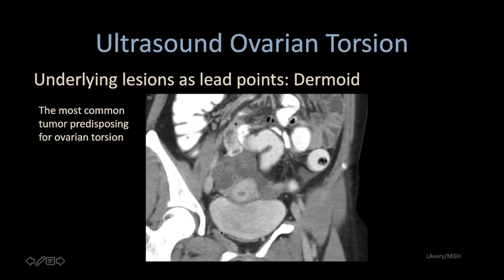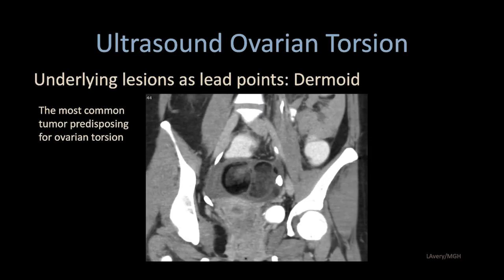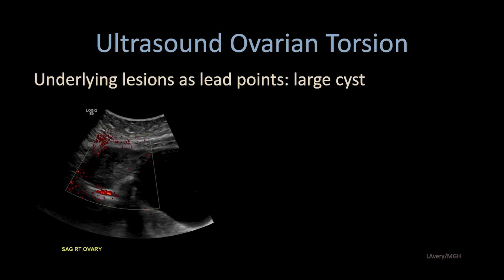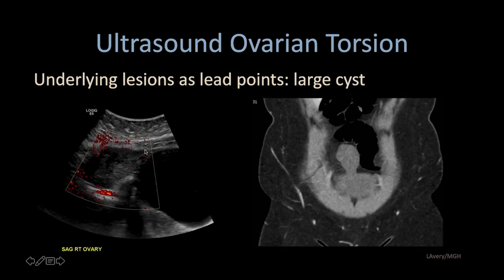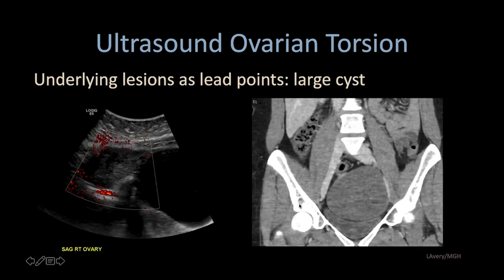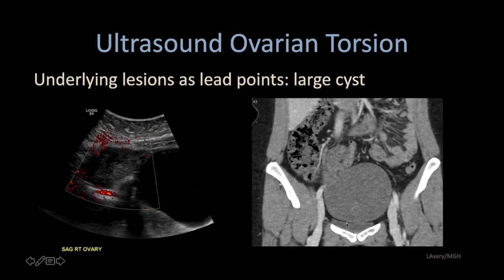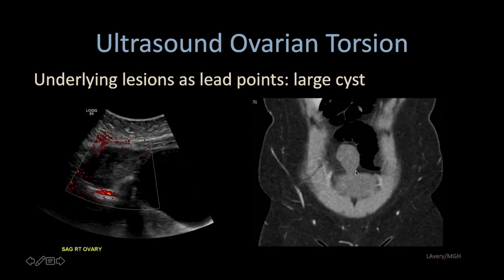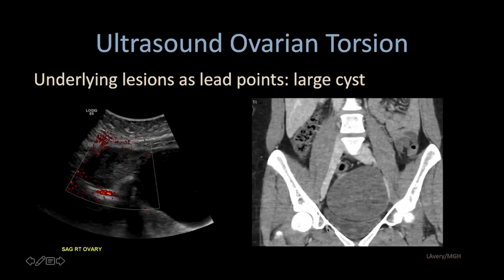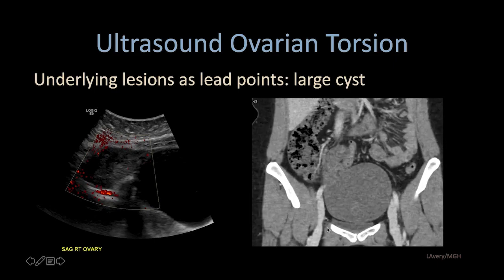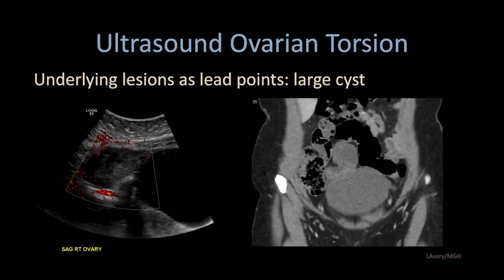Ovarian dermoids are the most common tumor that predisposes to ovarian torsion. Here we have a very hard to visualize ovary without any blood flow, but a very large cystic lesion. This patient went on to CT scan, and on coronal images you can see this huge cyst — that's the bladder down here — and a large torsion ovary in the midline. This was torsion from a large cystic lesion as the lead point.